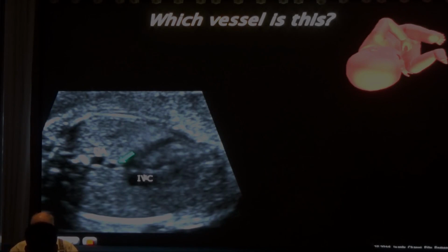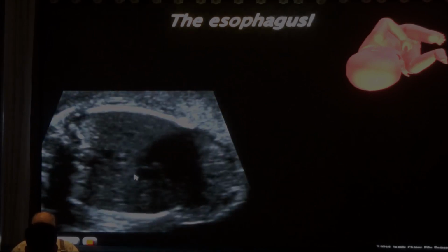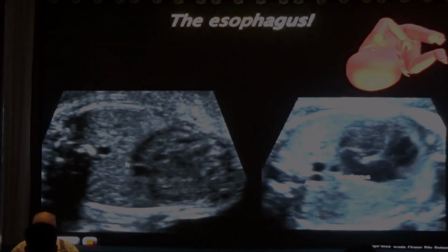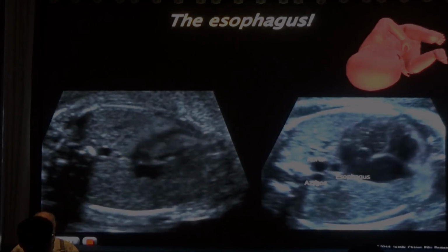And so I'm making this appear. What was that? Photoshop? Not Photoshop. This is the esophagus. Baby swallows fluid, and you see the fluid go through the esophagus. That's a normal finding. Another one here: aorta, esophagus, azygos.